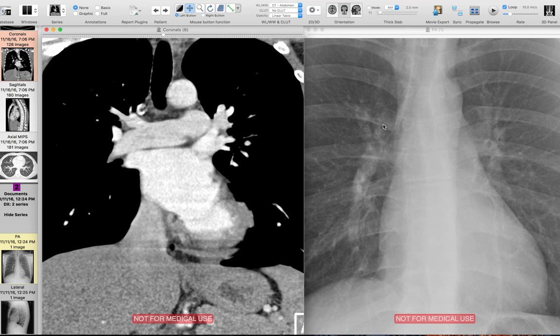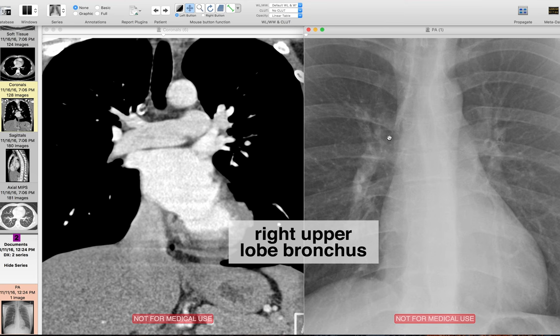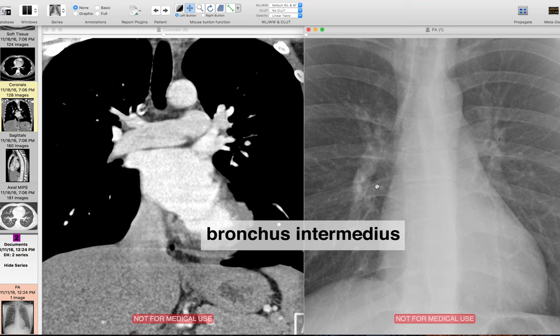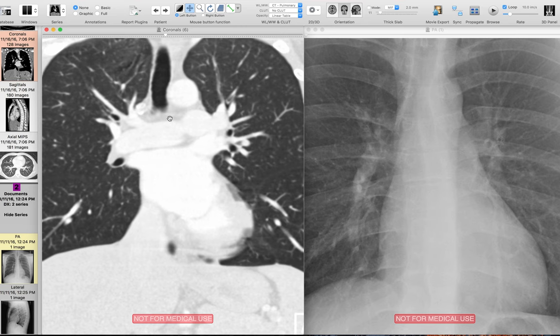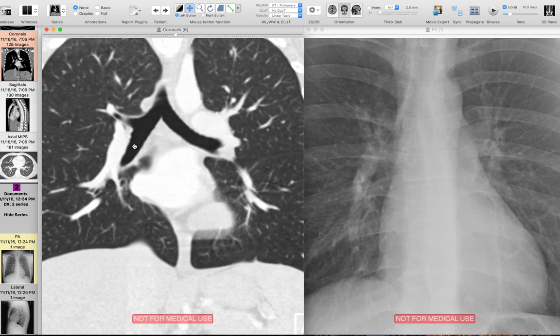Now for the bronchi — the bronchi are seen not as opacities, but as lucencies. This is the trachea, this is the right main bronchus, and in the right hilum we can see part of the right upper lobe bronchus coming off, with the larger structure going inferiorly being the bronchus intermedius. On the CT: here's the trachea, the carina, the right main bronchus, the right upper lobe bronchus, and then the bronchus intermedius, which gives rise to the middle and lower lobes. Just lateral to that is the interlobar pulmonary artery.